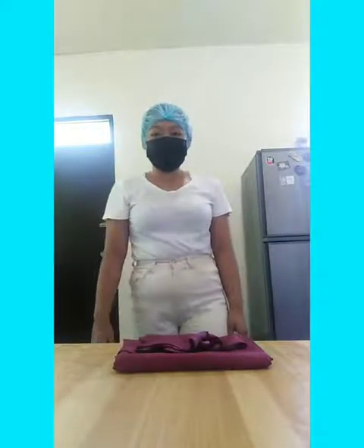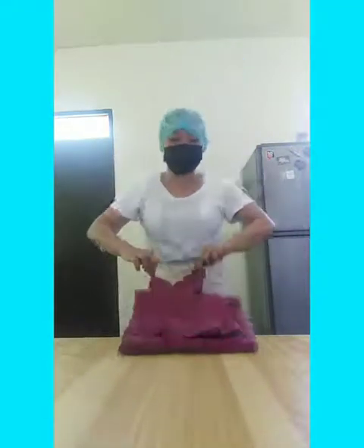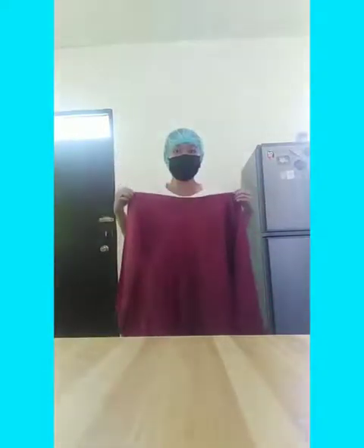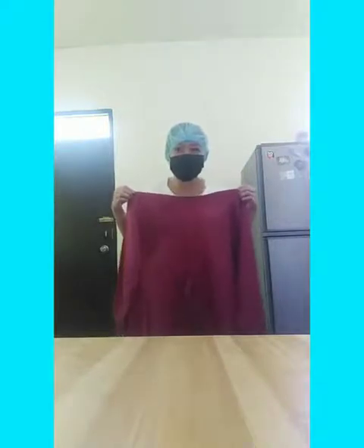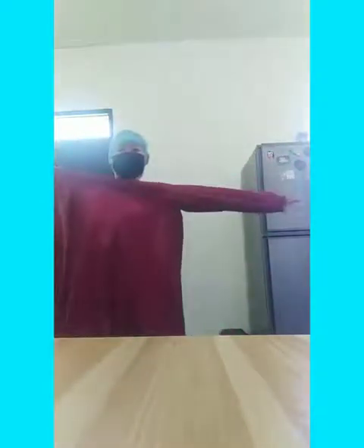After the surgical hand washing, suppose that I already opened the outer and the inner wrapper of my gown. So, to don the gown properly, the scrub person should grasp the folded gown at the neck and lift it directly upward from the sterile package. Step back from the table into an obstacle-free area. Carefully locate the gown's neckband and hold the inside front of the gown just below the band with both hands. Hold the hands at shoulder level and slip both arms into the sleeves of the gown until the hands reach the nearest edge of the cuff.